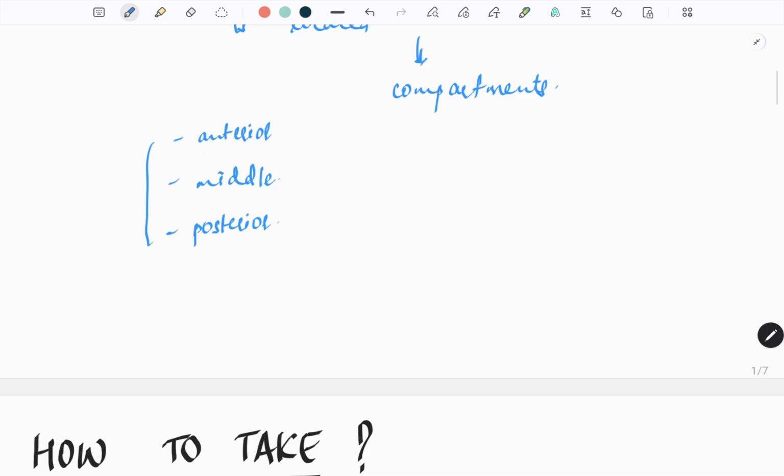We'll come to the characterization part later on.